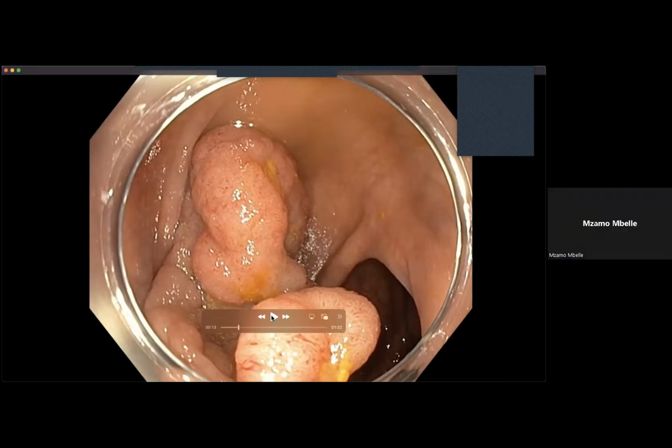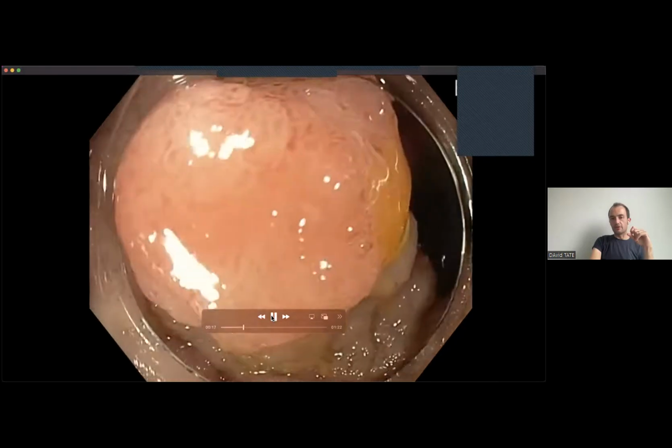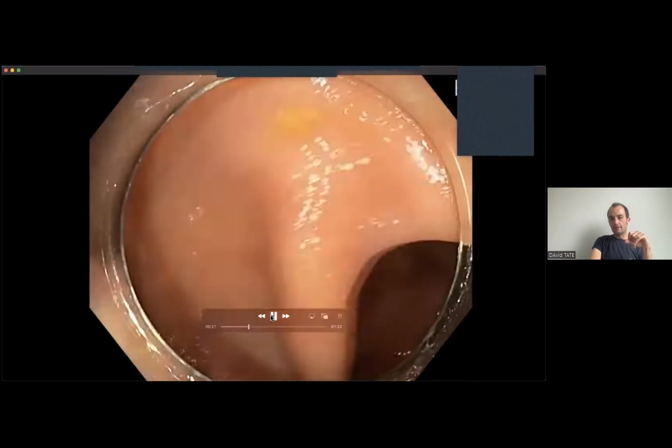My first impression is that it's a lateral spreading tumor, not necessarily cancer at this point in time. Perfect. That's a great answer. Lots of things in that answer which are very good. We'll come back to that in a minute. Okay, so now you're getting a bit more detail.